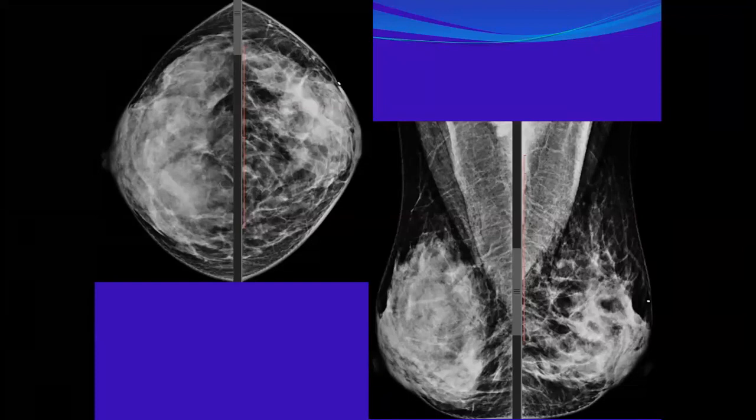It could be a normal variant. Sarah, you said it could be a normal variant. Let Sarah continue, and then we will open it to the rest. Yes, it could be a normal variant. Excellent, well done. You are right.